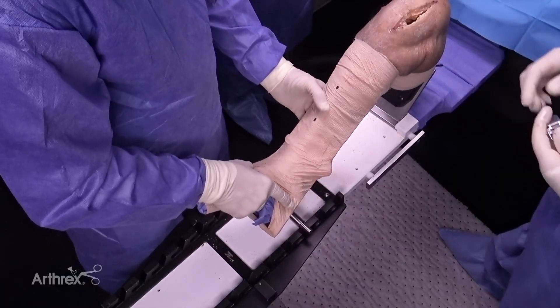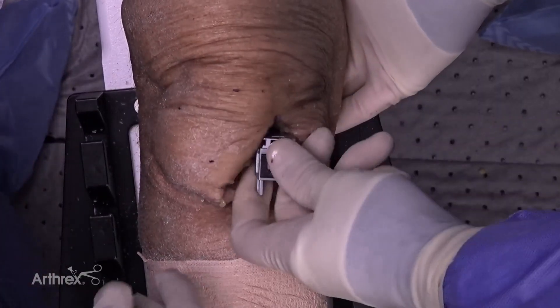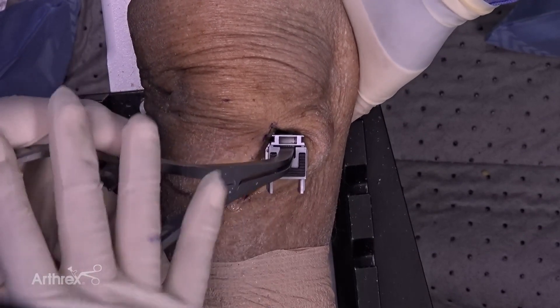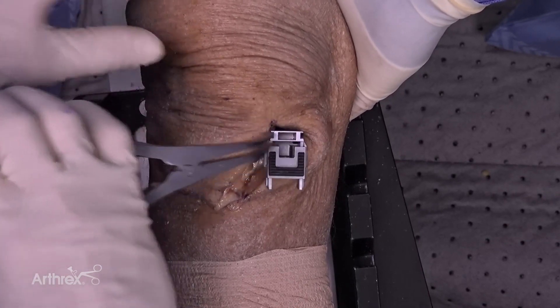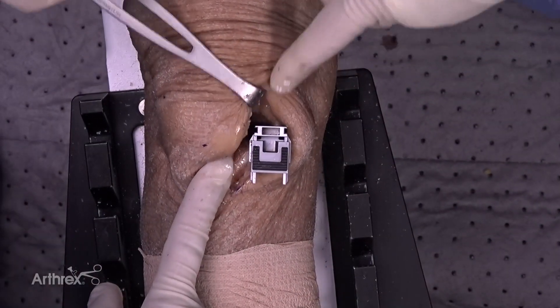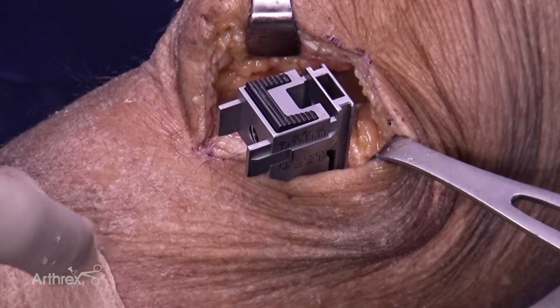Once we have measured our flexion space, we take out the tensioner, extend the knee, and now measure our resultant extension space. We again place the adjustable spacer block in, and tension it to the same tension used in flexion. It measures nine in this instance as well. They do not need to be the same and often are not, but this gives us our extension space.